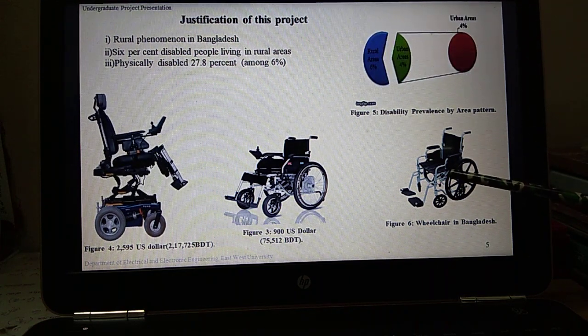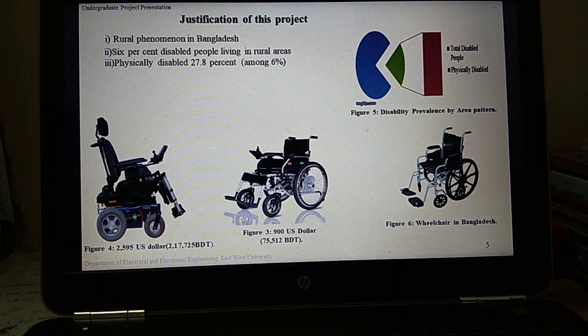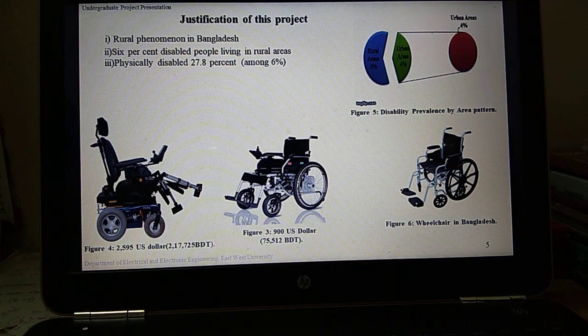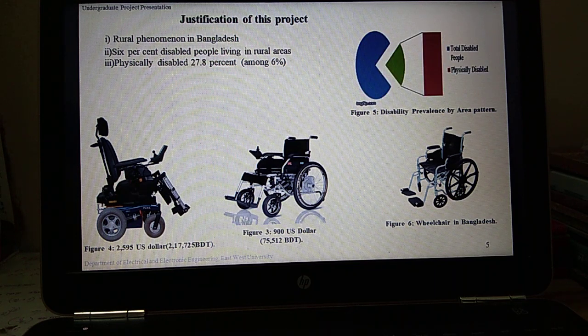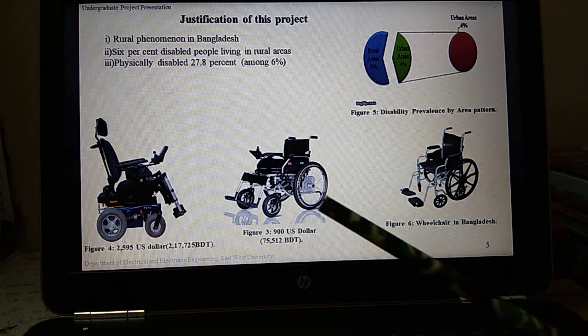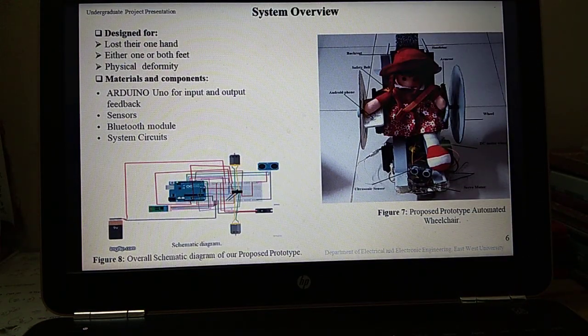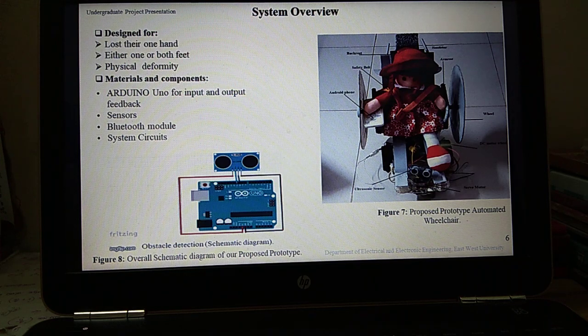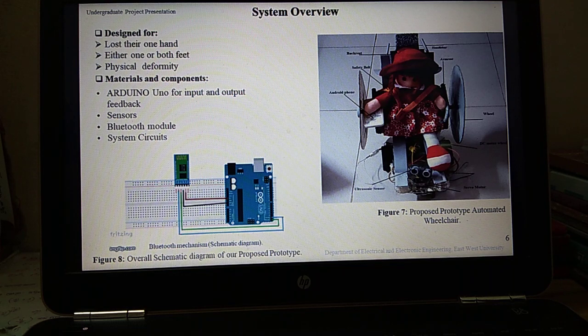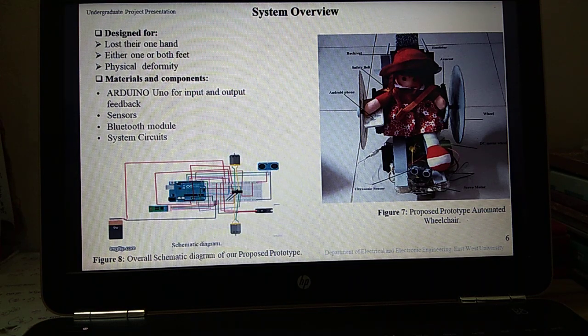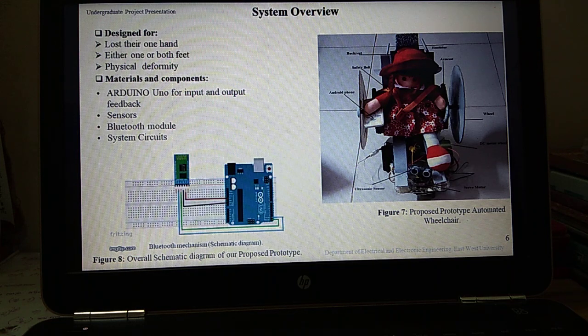Similar types of manual wheelchairs are available in Bangladesh, so we tried to design a prototype so that in future by using this type of manual wheelchair we can make an automated wheelchair with more features but at an affordable price. Persons have different types of physical disabilities, but this prototype is designed for those people who have lost their one hand, lost sensation partly or wholly of one hand, lost either one or both feet, or have physical deformity and abnormality.